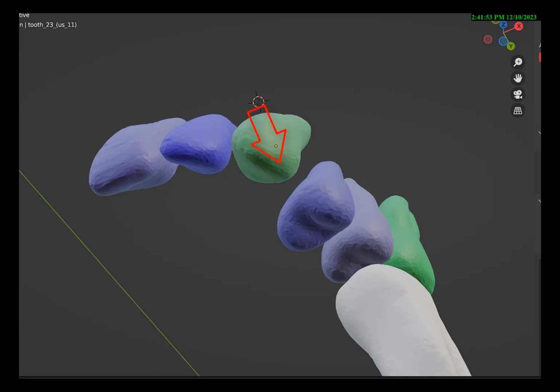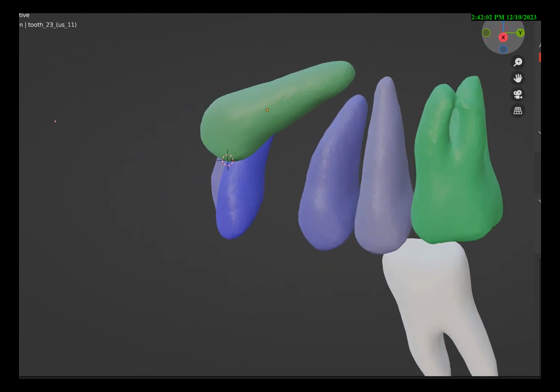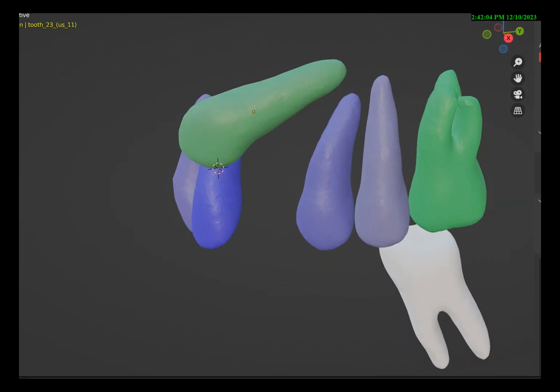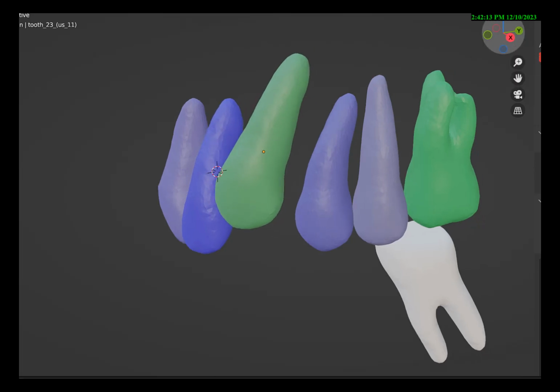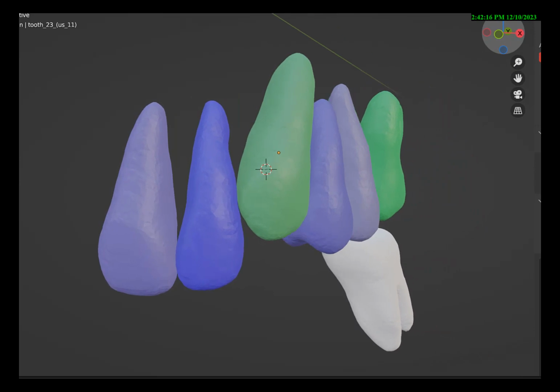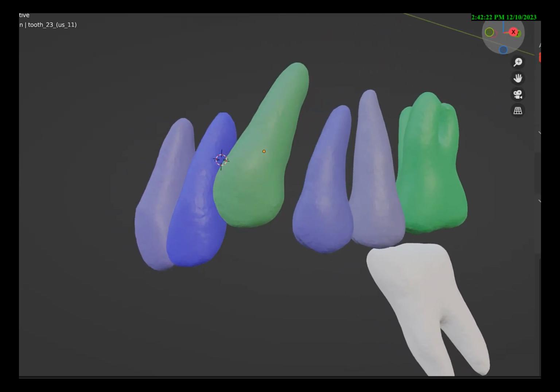So now what you're doing is bringing the tooth here and you torque the root. Let's see this from a different perspective. From this perspective, the tooth is moving down and getting away from the root. So you can start thinking of moving the tooth down, which you can see is now very close, but probably should be a little bit better managed. But let's assume that you've pushed the tooth a little bit more distal.